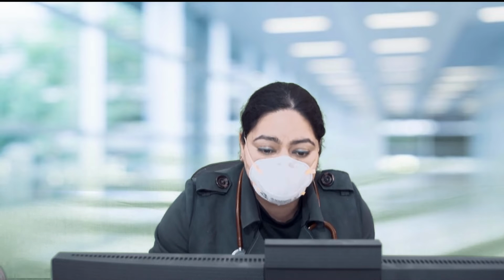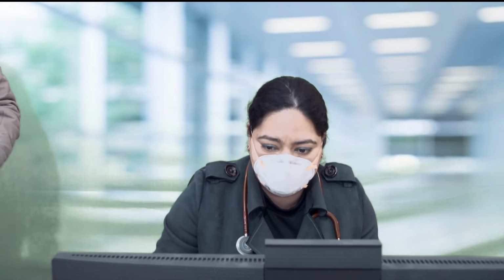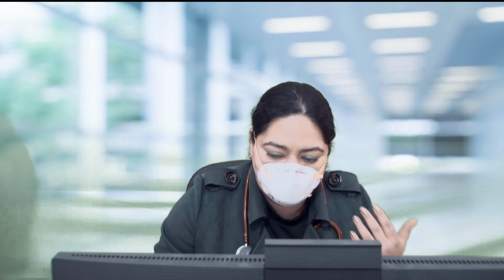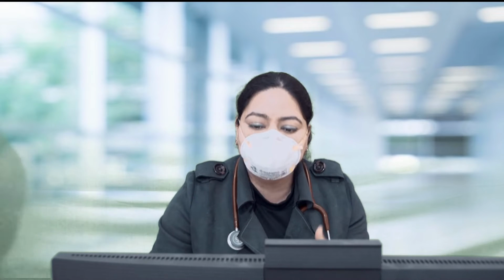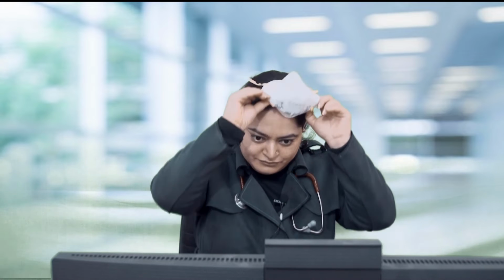The third is inability to fix the interface. If the patient has any facial trauma, facial abnormalities, or anything where we cannot use the mask on the patient, in these patients we should not try BIPAP support. Other is severe GI symptoms, like severe vomiting, obstructive bowel, and severe hematemesis. In these patients, NIV should not be used because if the patient is vomiting, then he won't be able to use the mask properly. In patients with massive hemoptysis, we should not use BIPAP.